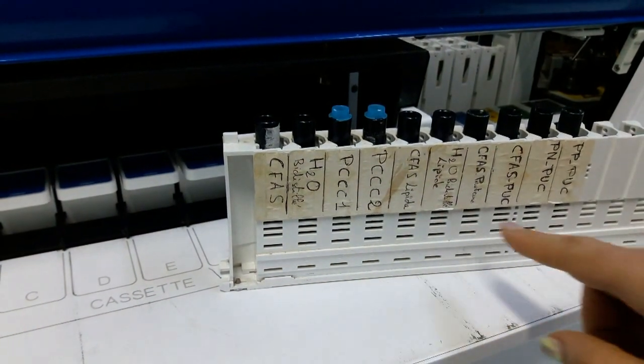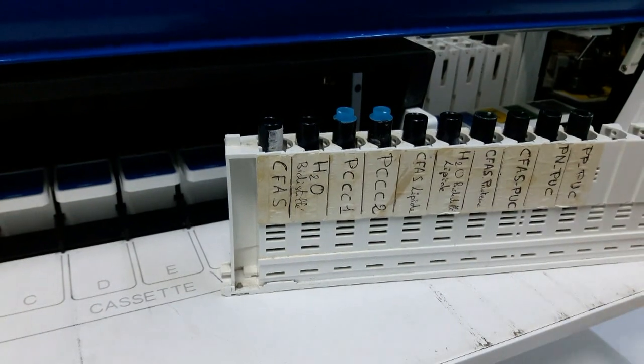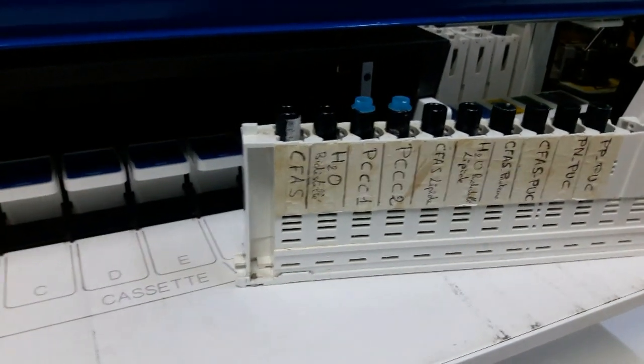Et puis les calibrateurs des CFAS lipides, calibrateurs de lipides, calibrateurs de protéines, calibrateurs pour les urines, etc.